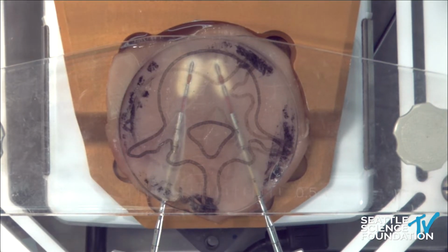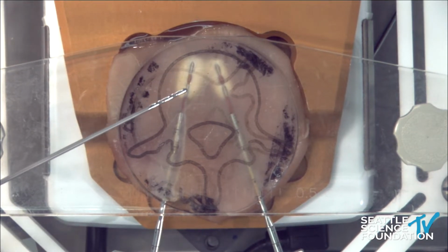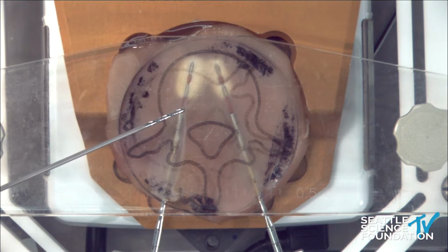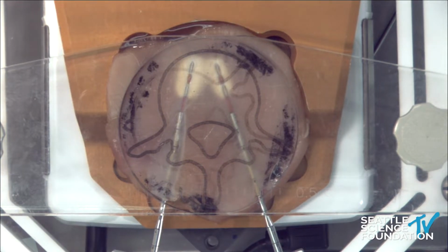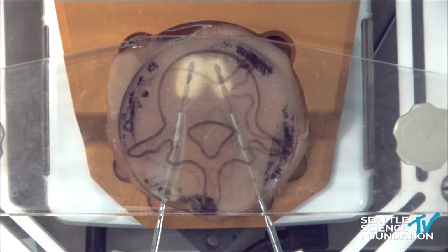So how warm does this get? So if it can cook chicken, the bronze area goes up to 95 degrees. Wow. And these areas, both distally and proximally, go up to 70 degrees. And so the irrigation cools the tissue so it doesn't get too hot? Yeah. So you don't want it to be well done? Yeah, so there's distilled water funneling through the tip of the needle, which cools off the tip of the needle. Is it cooking right now?